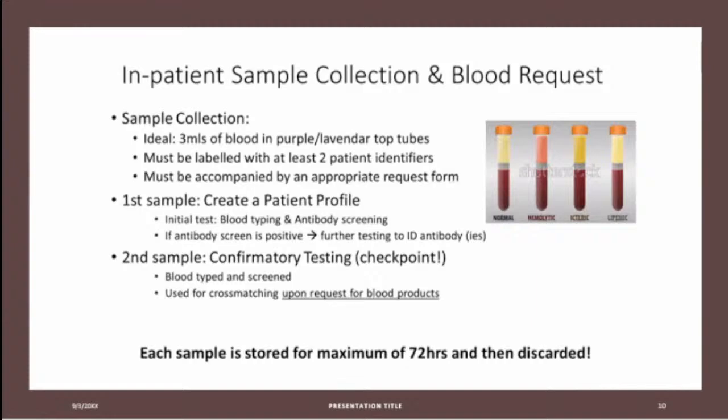So if you bring a sample down that just has a label, the unique identifier of that sample for us to have traceability in the laboratory and throughout the system will not be possible if we use the SunQuest labels. So you will need to send a request form for blood, even though you may have placed it in the SunQuest system.